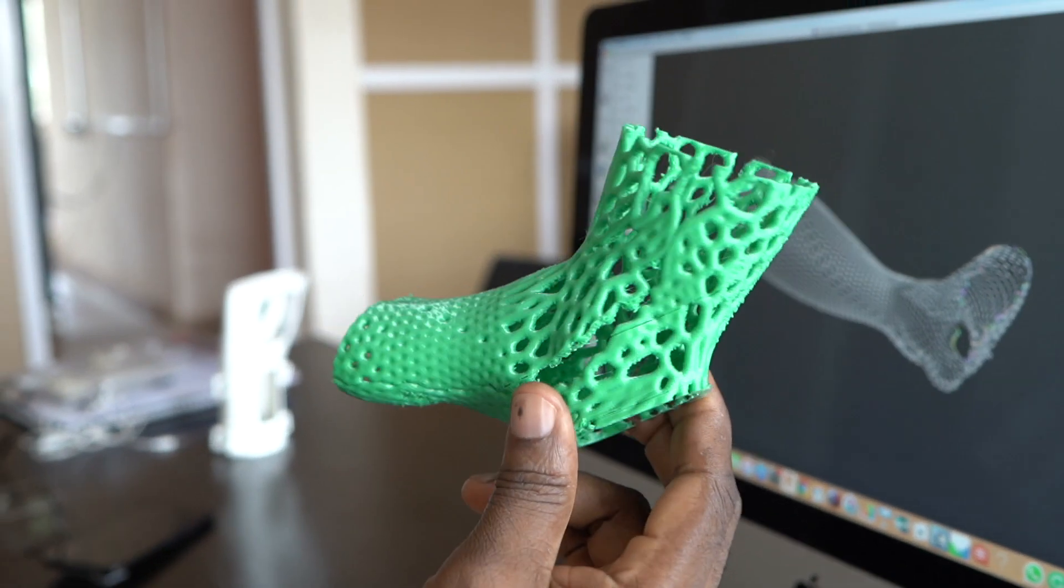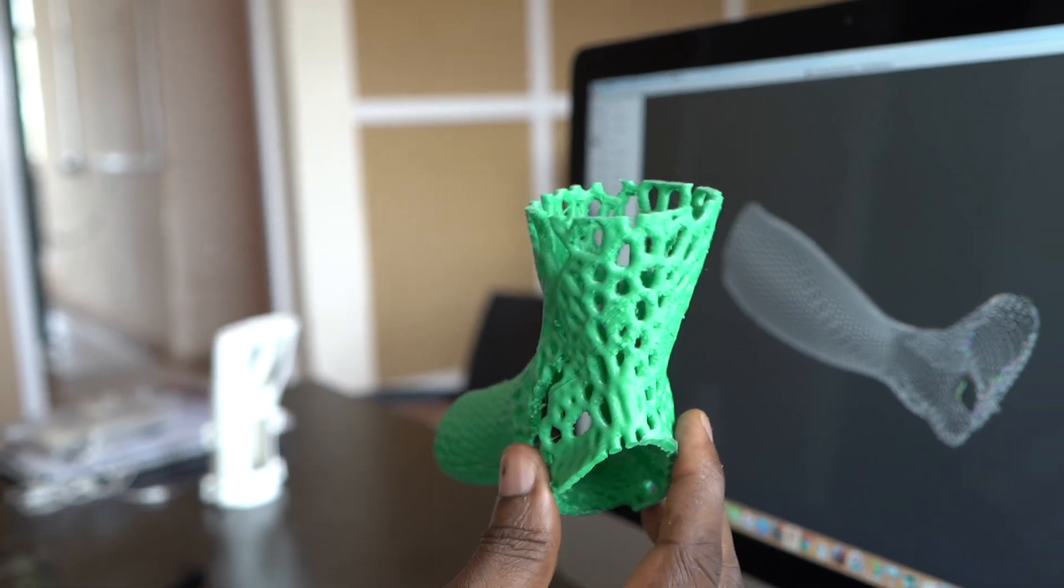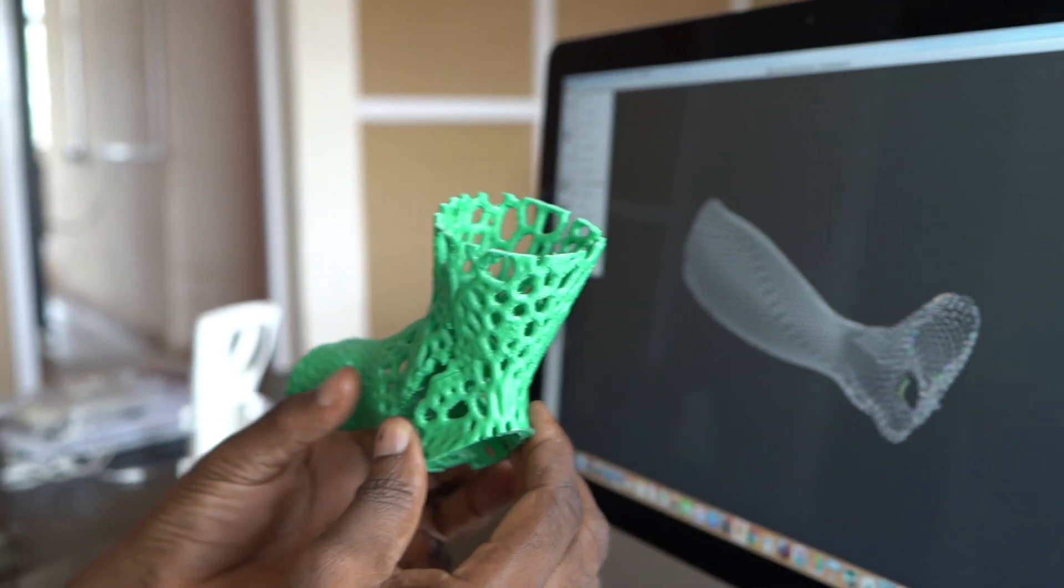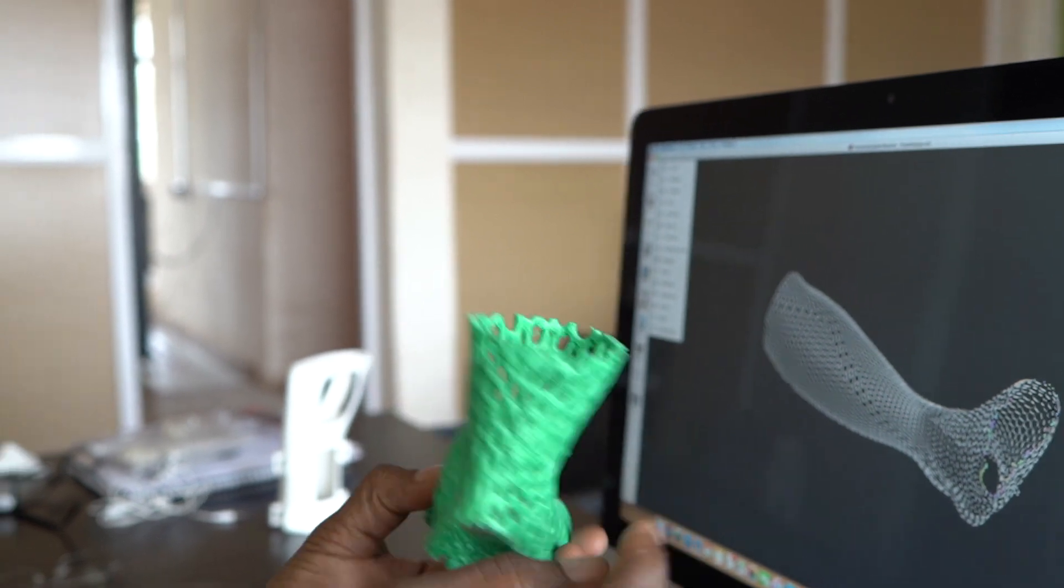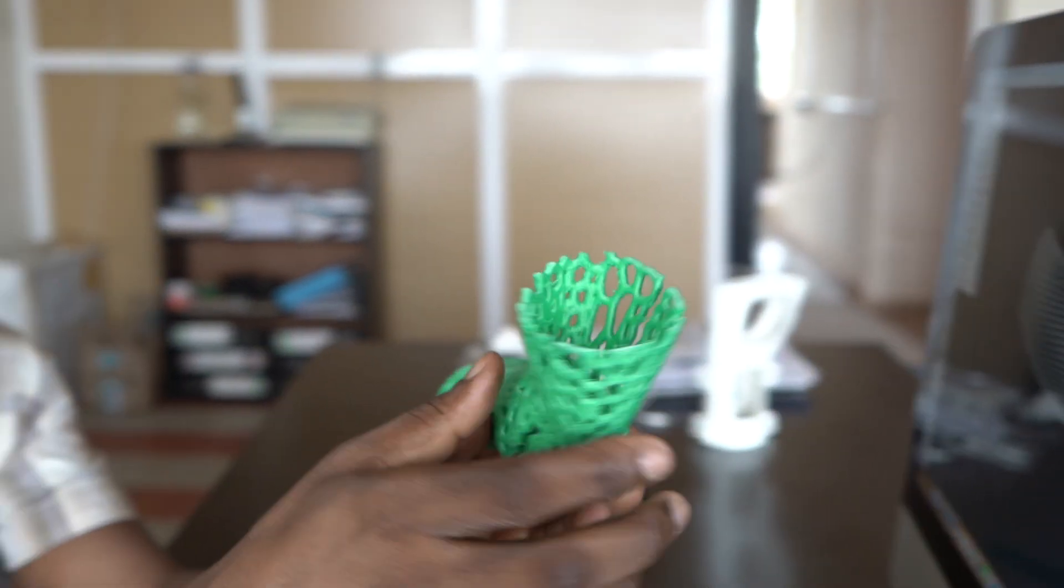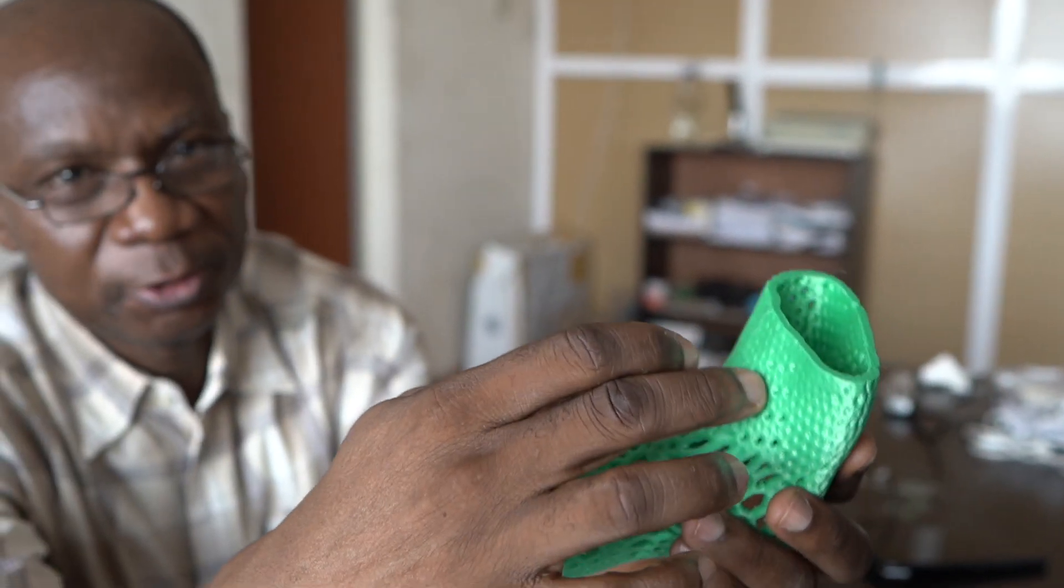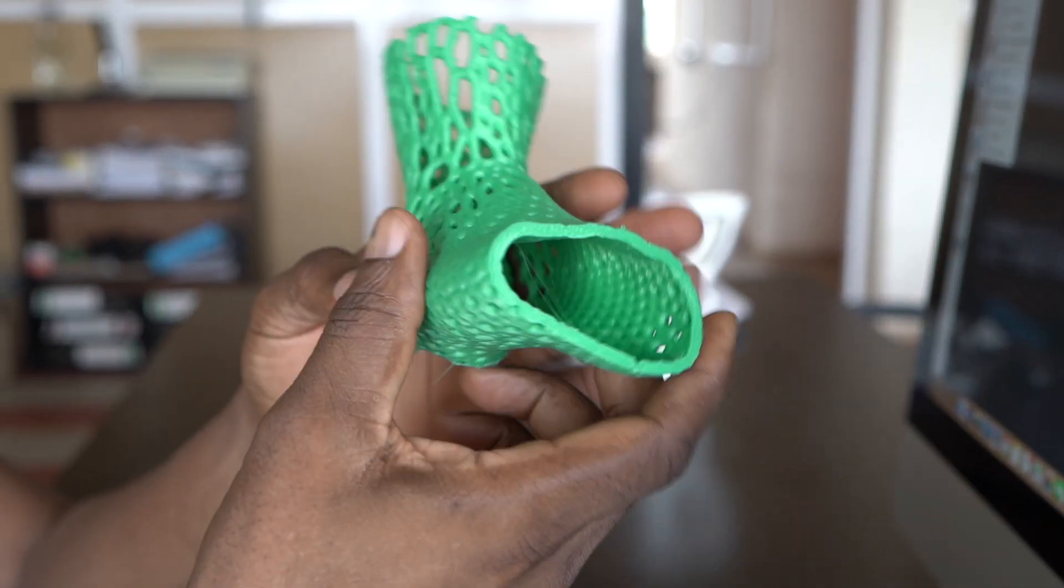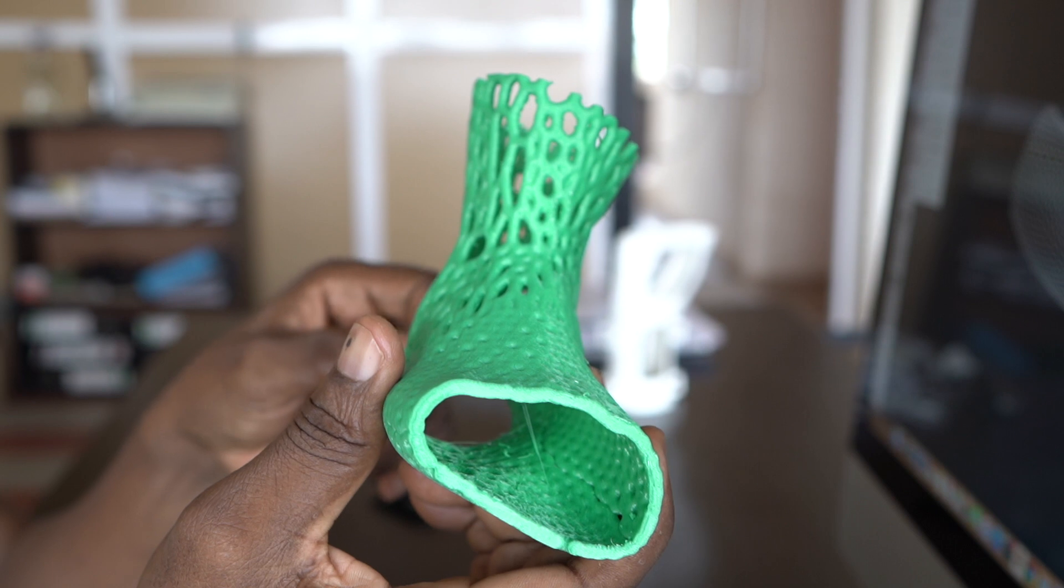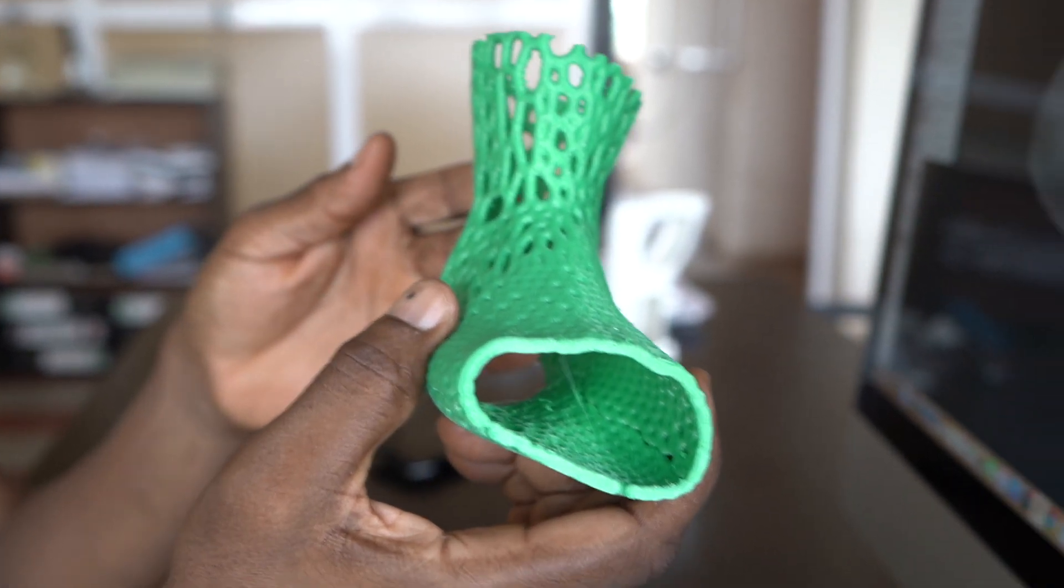What I'm holding here is a test print. You could call it an ankle brace. You can see the design, the mesh, and the toe portion removed. This is lightweight, solid, rigid, sturdy, and strong.